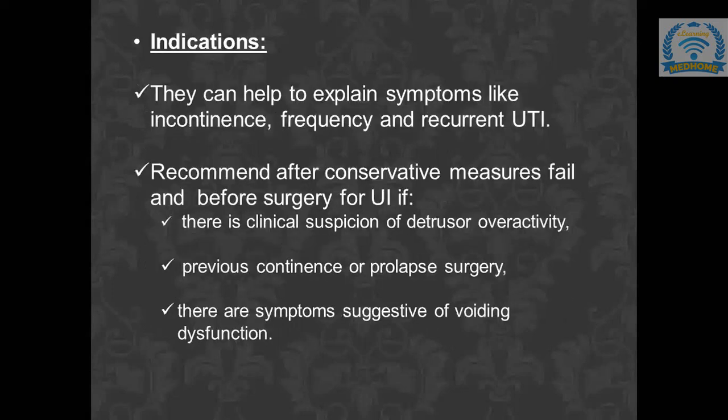Now the indications: why do we perform it? We perform it to explain the symptoms of incontinence, frequency or recurrent urinary tract infection. It is recommended when there is any clinical suspicion of detrusor overactivity, when a previous incontinence or prolapse surgery failed and the patient has come to us again with symptoms of urinary incontinence, or when we suspect the patient has symptoms suggestive of voiding dysfunction.